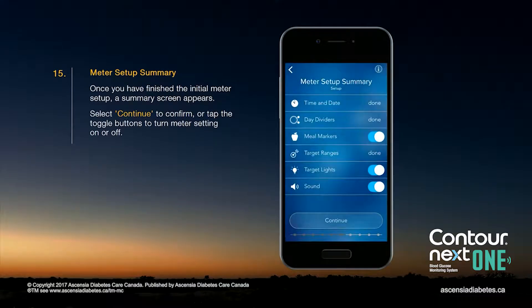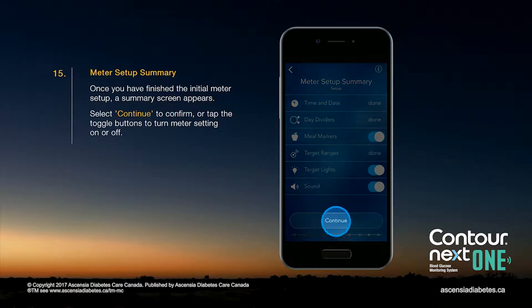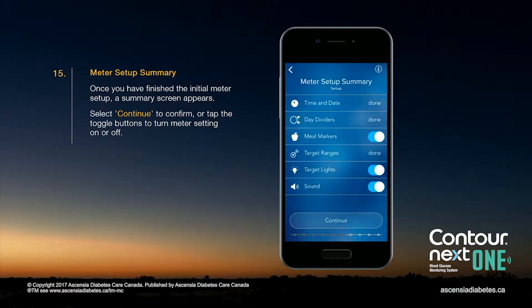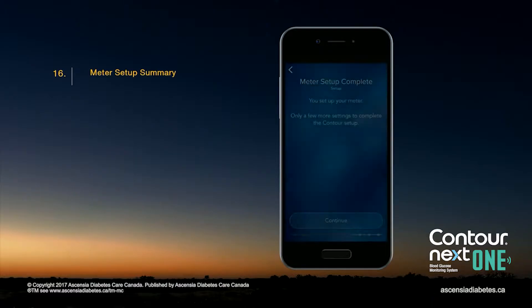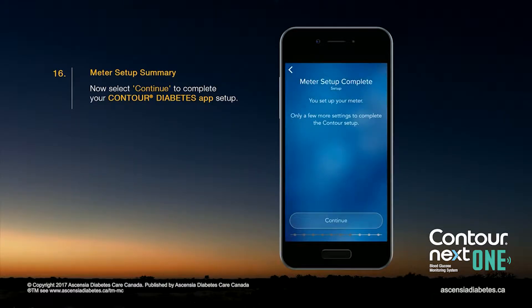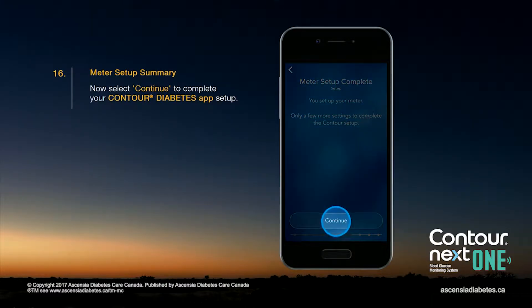Once you have finished the initial meter setup, a summary screen appears. Select Continue to confirm, or tap the toggle buttons to turn meter settings on or off. Now select Continue to complete your Contour Diabetes app setup.